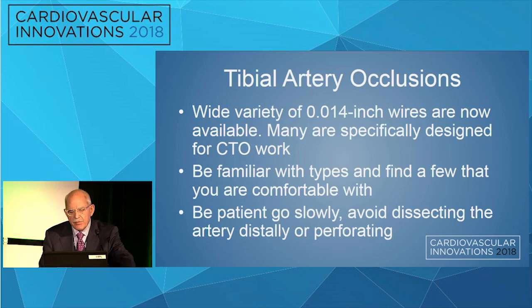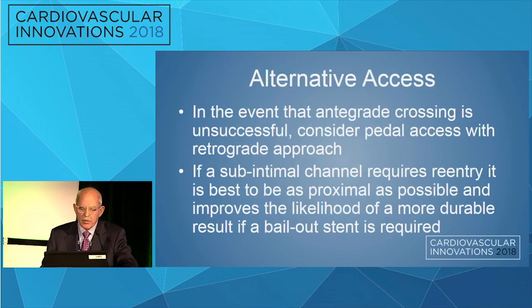Again, a wide variety of wires are now available. Many are specifically designed for CTO. Be familiar with the types and find a few that you're comfortable with. Make that your workhorse wire. Be patient, go slowly, avoid dissecting the artery or potentially disrupting it.